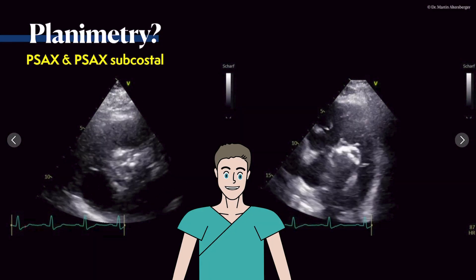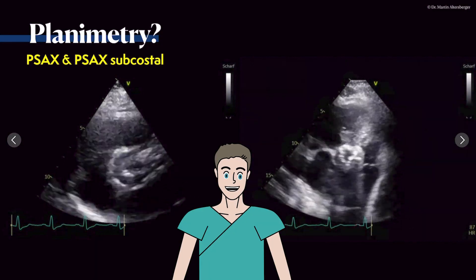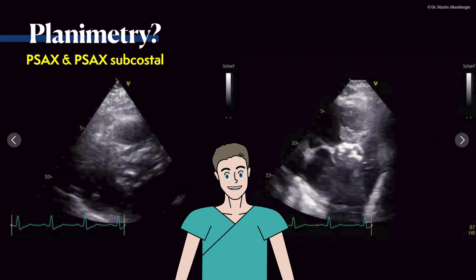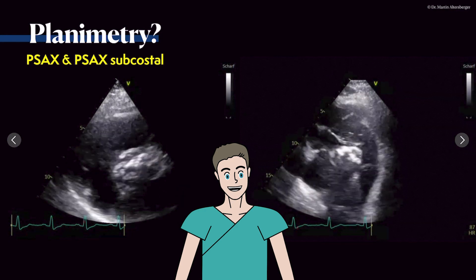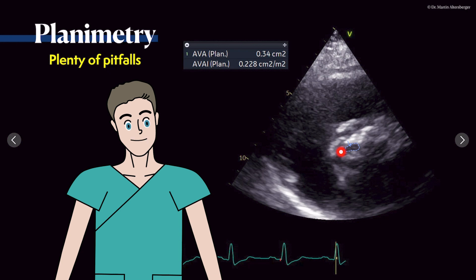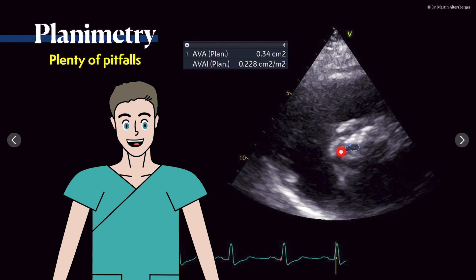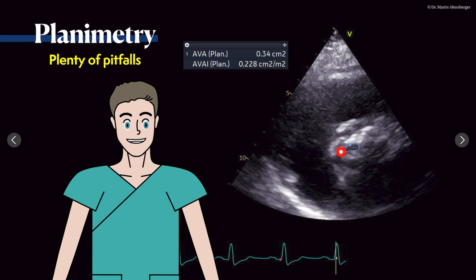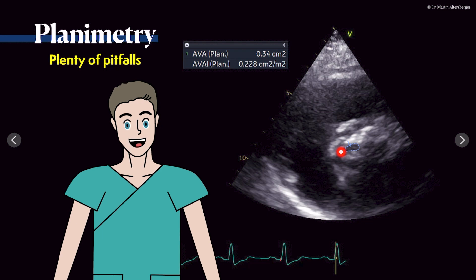Very often you will also want to try planimetry. You can do that in a parasternal short axis or in a subcostal view, but keep in mind that planimetry has plenty of pitfalls. First of all, the actual area you measure may not be the same as the calculated area, because the flow and functionality of the valve sometimes differs slightly from the anatomy — so it's not always entirely the same.